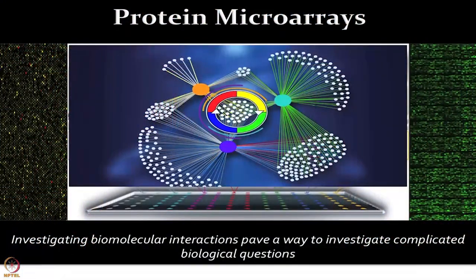So, one could actually use them as early detection biomarkers, because one could do the testing from the blood with a routine kind of blood based test which people usually do for the health checkup. So, protein microarrays provide one of the strong platforms to look into this autoantibody screening from the patient's serum or plasma samples. As we have seen, protein microarrays offer a variety of applications and different ways one could make the arrays, which are essentially miniaturized arrays where you can print your proteins or your cDNA and make the proteins from that, which could be utilized for many applications. But biomarker screening using autoantibodies is one of the very important applications which we are going to focus on today.